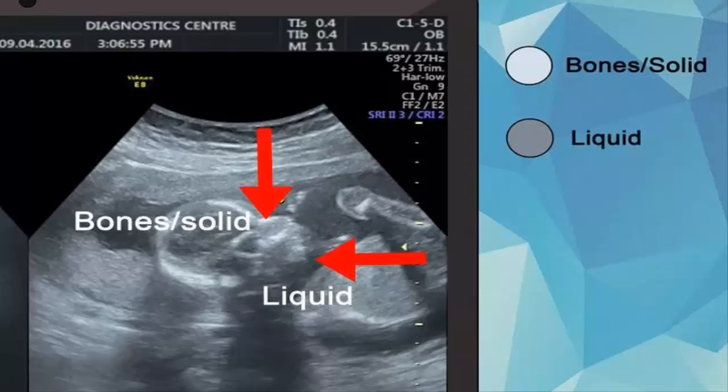4. Watch for common visual effects. Since ultrasound uses sound to create images of the inner structures of your body, the images are not crystal clear. There are many different visual effects that can happen as a result of the ultrasound's settings, angle, or of the density of the tissues being examined. Some of the most common visual effects to watch for include enhancement. This is when part of the structure being examined appears brighter than it should due to an excess of fluids in the area, such as in a cyst.